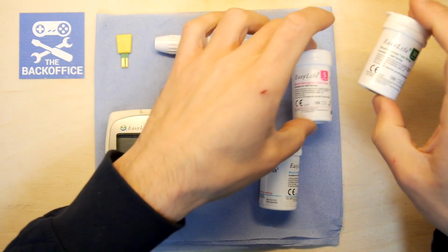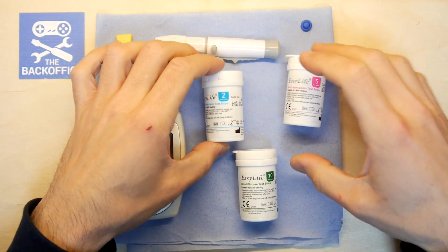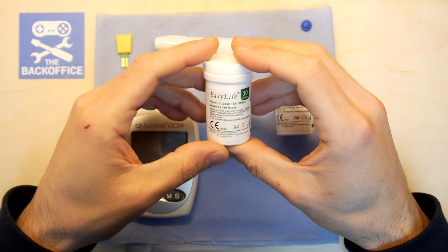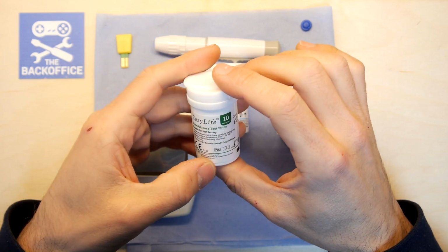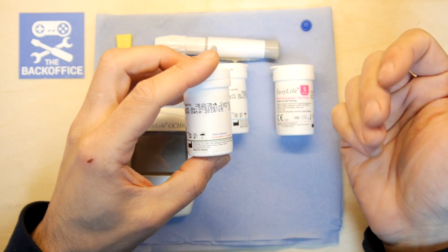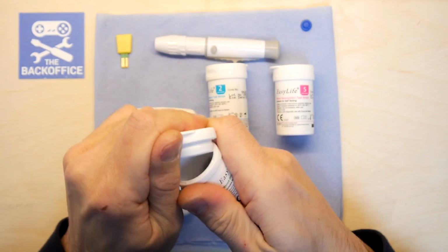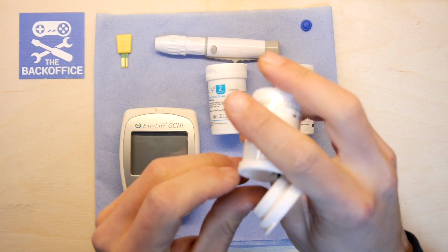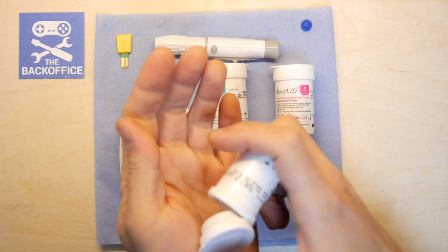Now, I don't know how much bloodletting I'm going to be up for today, although I probably want to test them all. I'm going to go for the blood glucose test strips because I have actually been fasting, and this would be a good test. I can cross compare this to the previous results and see if I am going to expire from an undiagnosed diabetes condition, which I kind of doubt, but you never know.